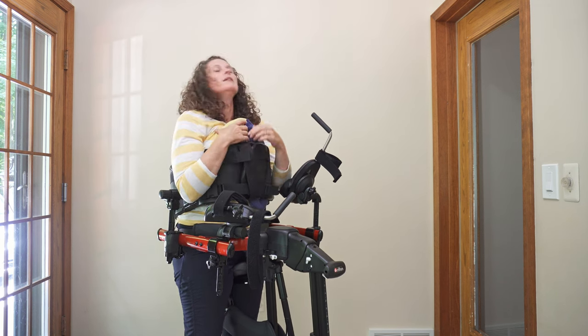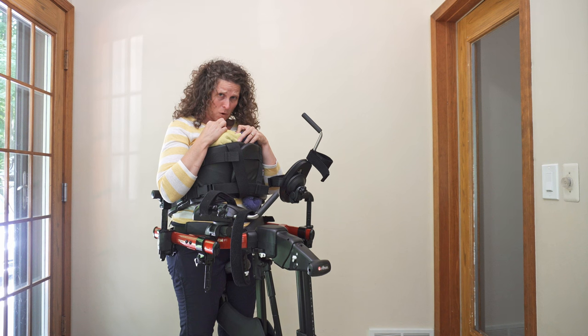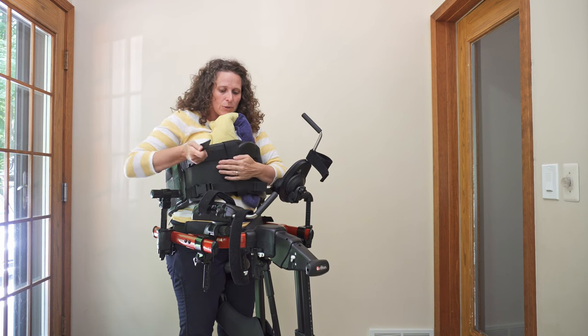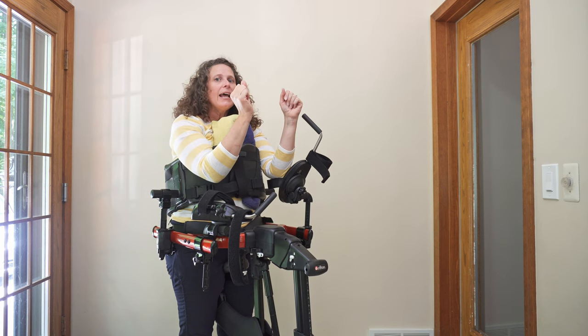What this does is for that individual who has really poor head control and their head is down — their chin is on the chest or on the chest prompt — it allows me to rest my chin on the towel roll so I'm here, and I only have to lift this much. It's a lot easier for them to get their head upright.